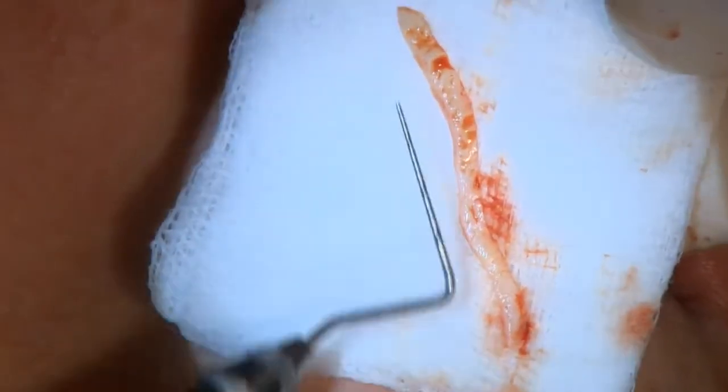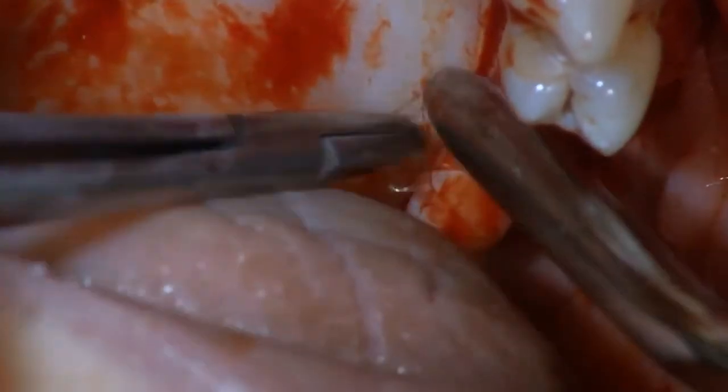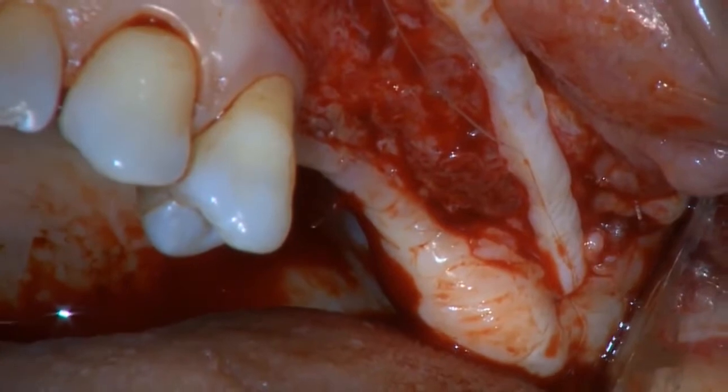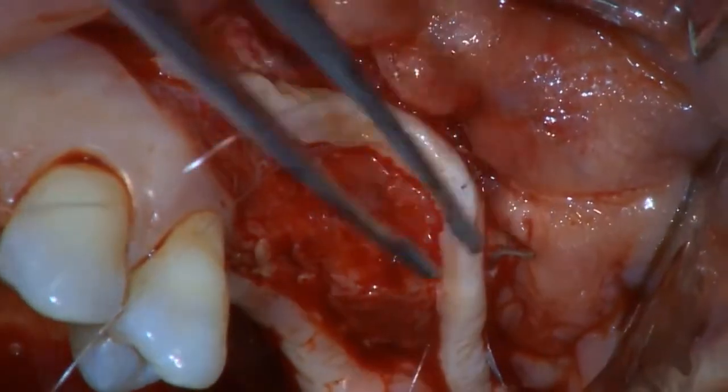The palatal wound is closed using a 5.0 Monocryl suture. Approximation of the wound margins is easy since the strip graft was so thin, and it favors uneventful healing. The graft is then immediately sutured in place with 6.0 resorbable monofilament sutures.